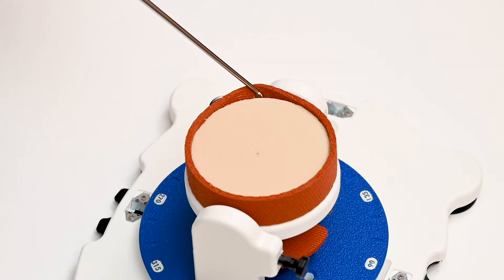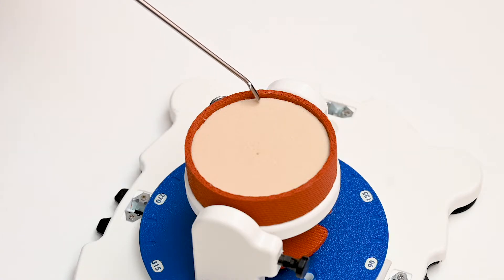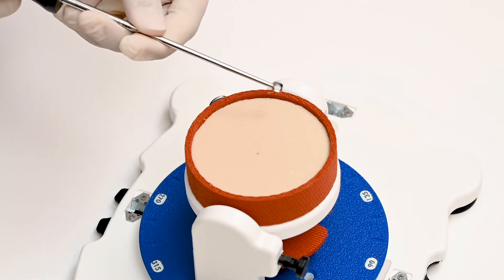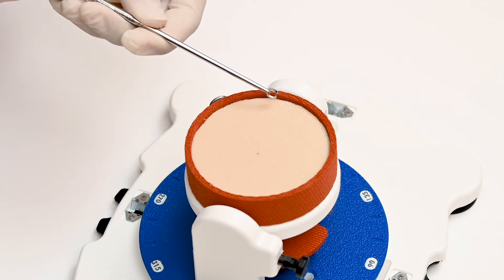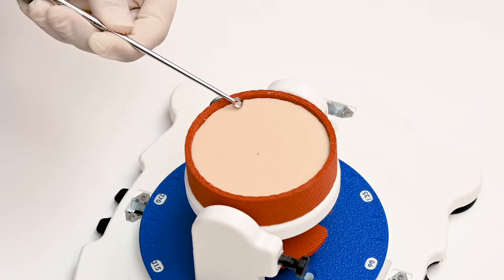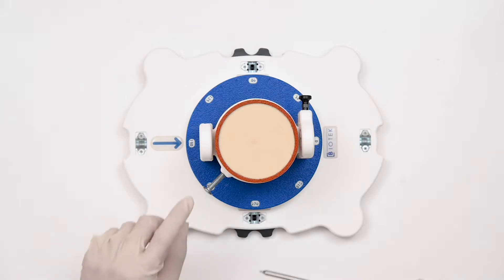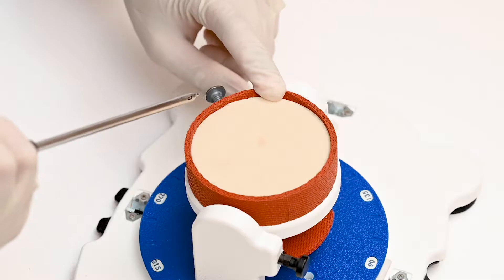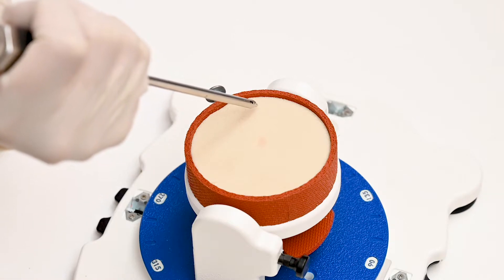Once tissue is mobilized and bleeding bone is created, we create an area over the medial surface for anchor insertion. We use a ring curette to remove a little bit of cartilage so that anchor insertion becomes easier over this area. For repair of the anterior labral element at six o'clock position, we position our anchor at around five-thirty.